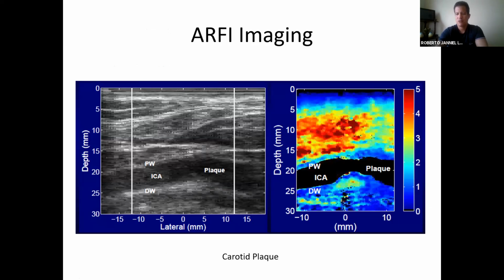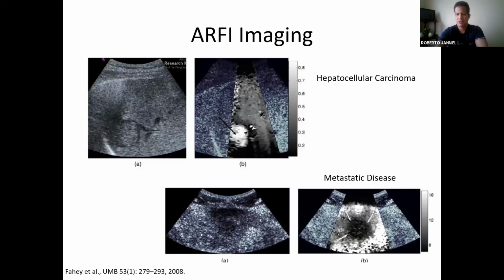This would be for carotid imaging. And in this case, it would be for hepatic imaging, right? And you can actually do all those kinds of things. And again, this is without the added need of applying an external vibration, which in practice would limit a lot of these applications. Everything is done just with the ultrasound scanner. The scanner applies the motion by using acoustic radiation force, and it tracks the displacements that you need to construct the elastograms by using just conventional ultrasonic imaging methods.